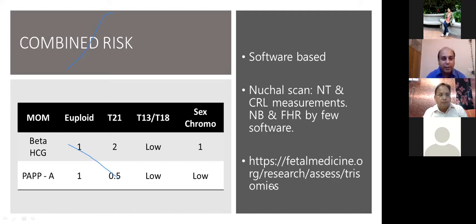We go to this site, and on this site, we can see fetal risk assessment is getting open. So we put the examination date. We put the examination date of 23rd today.